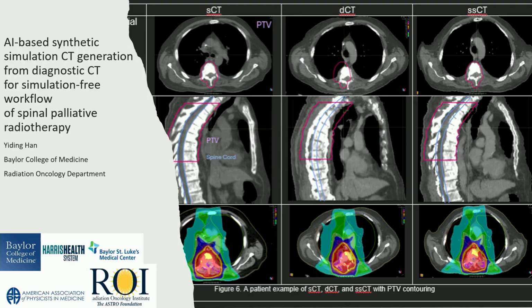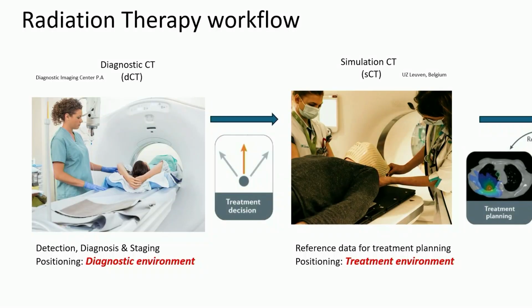Today I'm going to introduce our group's work using AI-based synthetic simulation CT generation from the diagnostic CT for a simulation-free workflow of spinal palliative radiotherapy. I know, a lot of words here, and I will explain one by one what that means. So first let me briefly introduce the radiation therapy workflow.